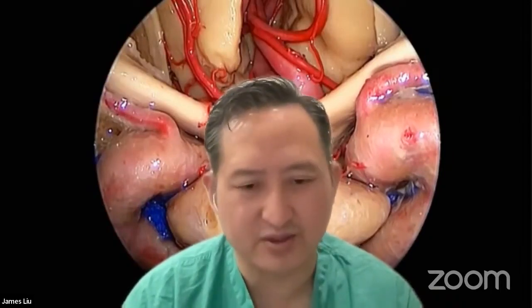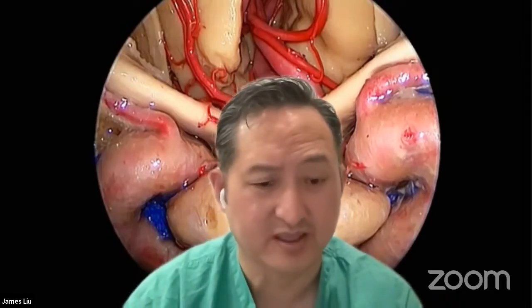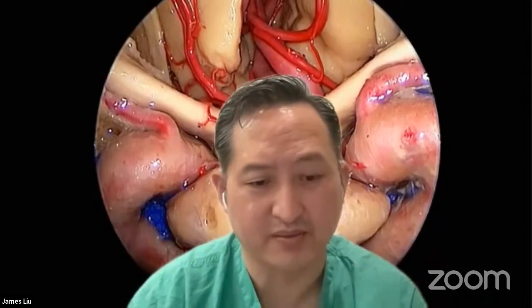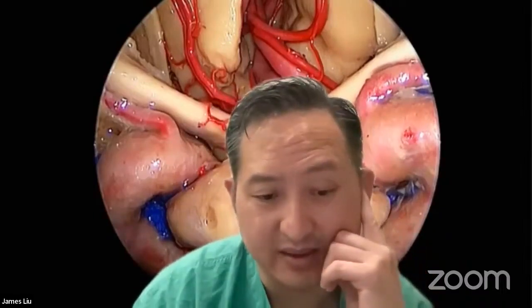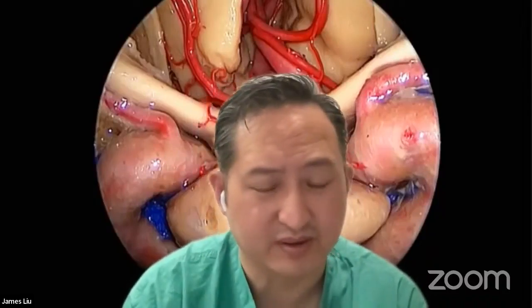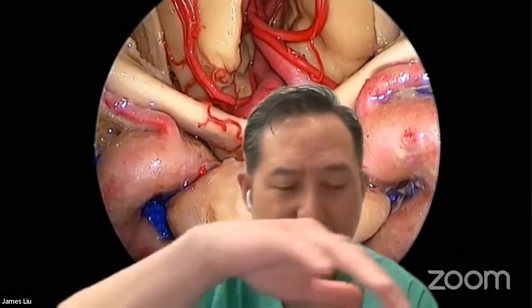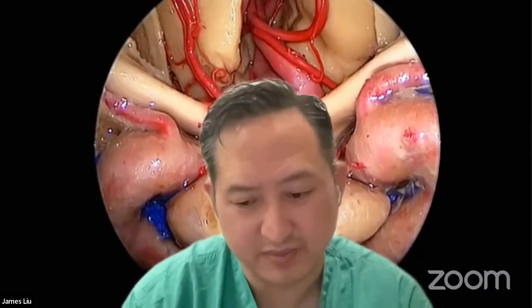But nevertheless, at surgery, we do a very thorough exploration of the gland, regardless of any lateralization. I think it's important to be very aggressive because in some cases you may have more than one adenoma within the gland. Those cases tend to be the most challenging when there's no clear-cut adenoma radiographically or intraoperatively, and you have to make decisions as to how you manage that. One technique that has been described in the literature, which we often will do on those difficult cases, is an aggressive hypophysectomy where you preserve the top layer of the gland that's adherent to the stalk and do a majority, two-thirds resection. That was described and published by Dr. Lillehei, and we generally do that, which has been effective in some cases.